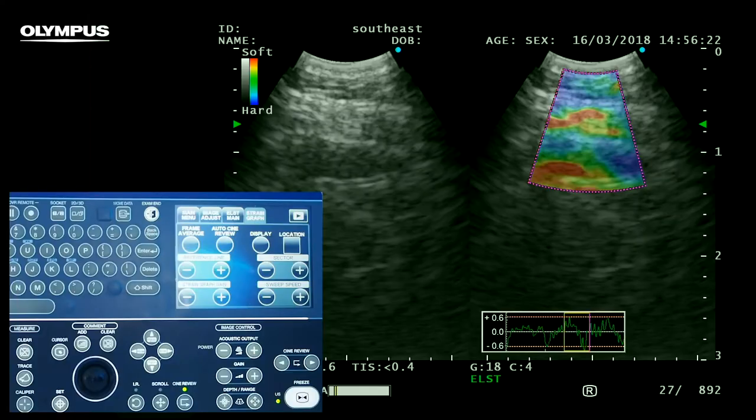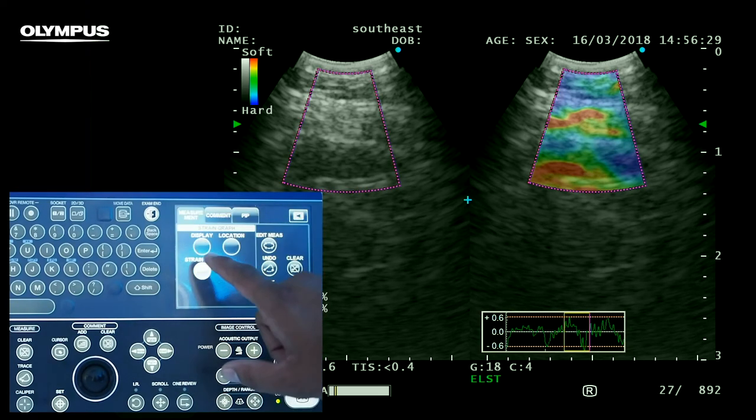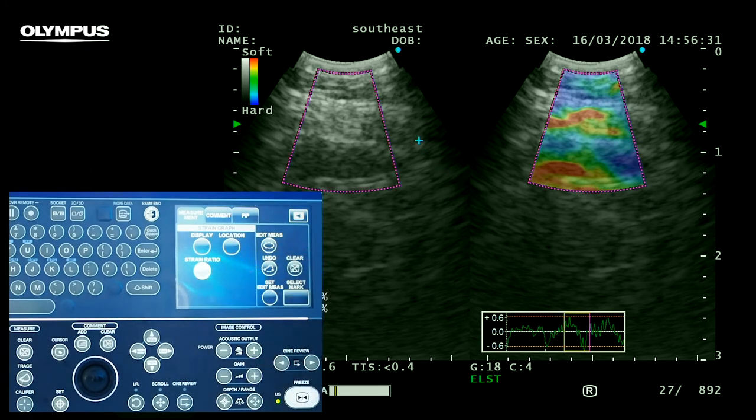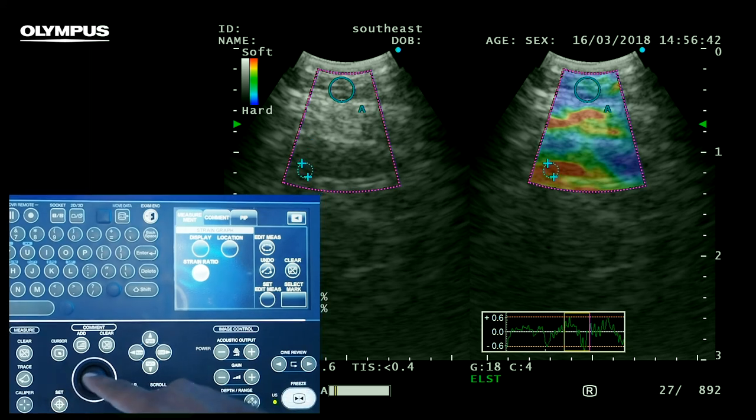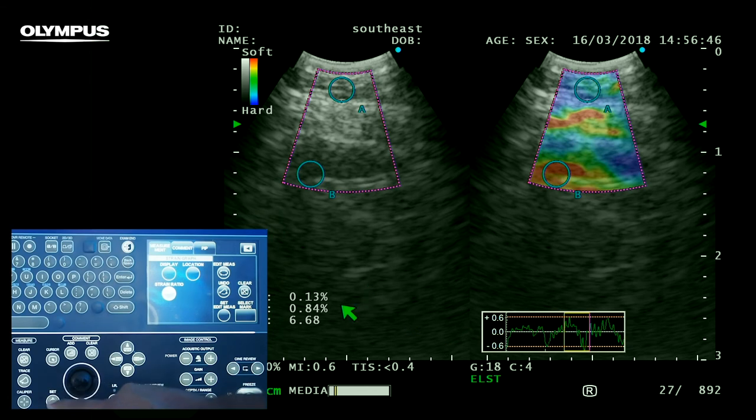If you want to extend your study, you can semi-quantify your results by using the strain ratio function. To perform the strain ratio measurement, simply press ratio under our main elasto tab. Then use both the trackball and the SET button to firstly outline your lesion and secondly an area of normal tissue. This will produce a strain ratio, which is displayed on screen.